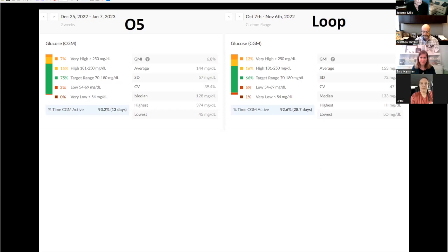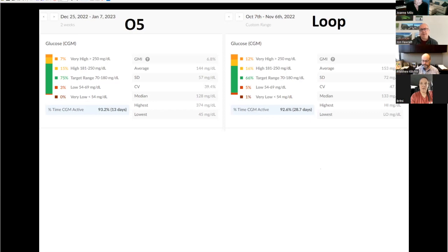Not a concern. And I would just encourage those people, this is a great example of what's going through my head. If your Loop target is under 110, Matthew, you said yours was 95 to 105 usually. Yeah. Well, if you're setting a target of say 100 or even 95 in Loop, if your A1C isn't 5, you're not hitting that as an average.